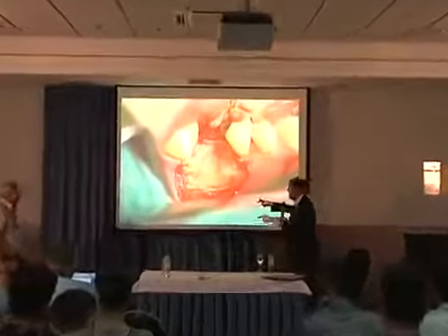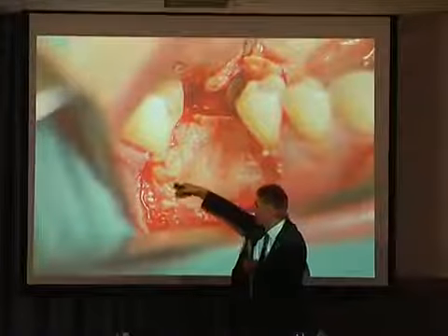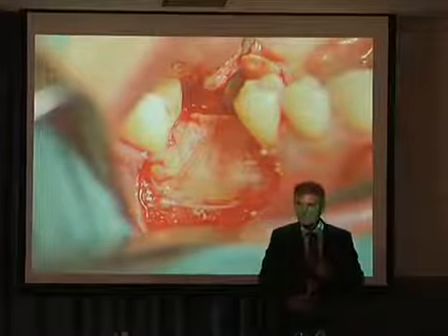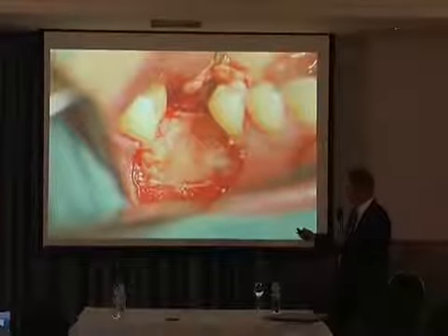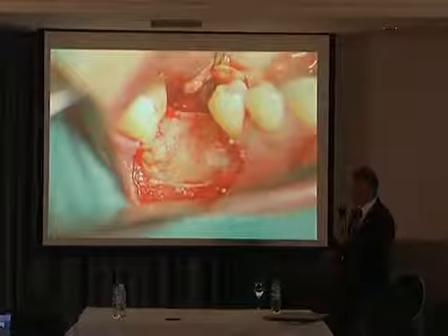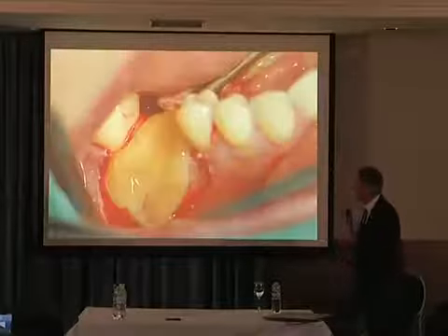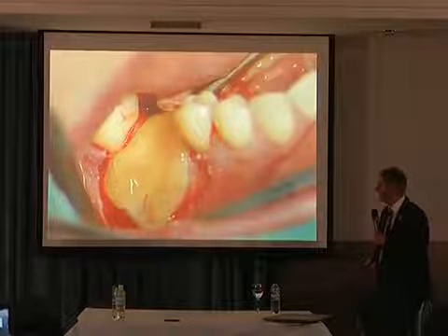Fixation of the membrane under the periosteal tunnel. Lingual, under the periosteum.